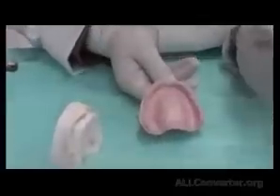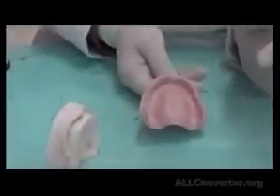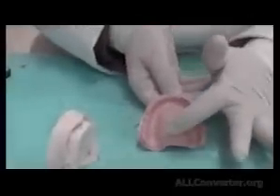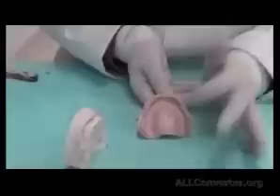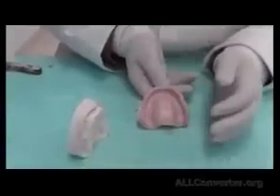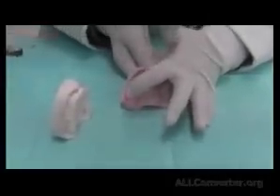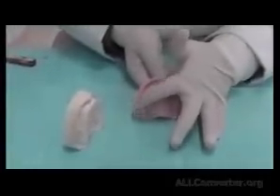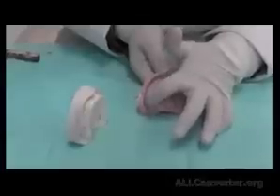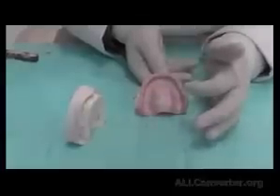If larger than this, I might correct it using some green stick, add a bit of green stick, put it back into the patient's mouth and press it, and come back and remove any excess on the fitting surface. This might be sufficient. If it's larger than that, we need to repeat the impression. If sulci are not present, if it's only on the length of the sulcus, we could add a green stick. If it's on the sulcus and some of the structures here, it's better to repeat the impression.